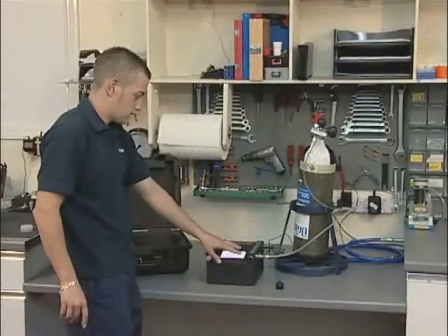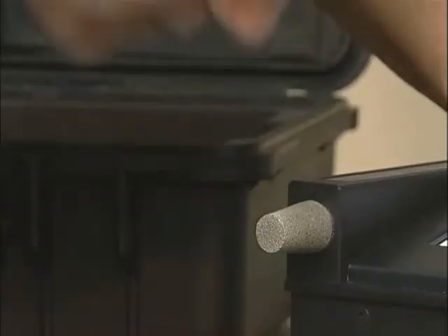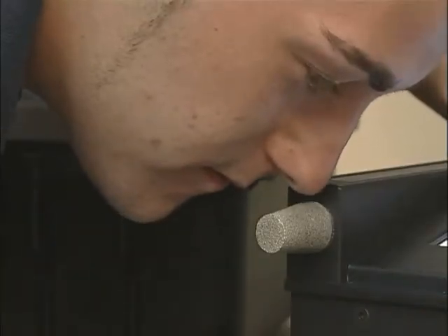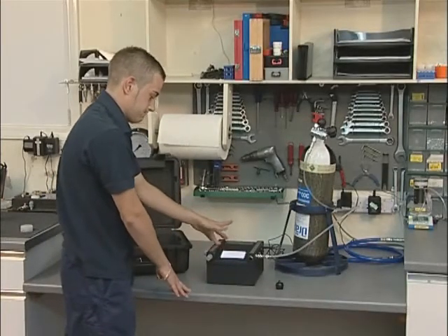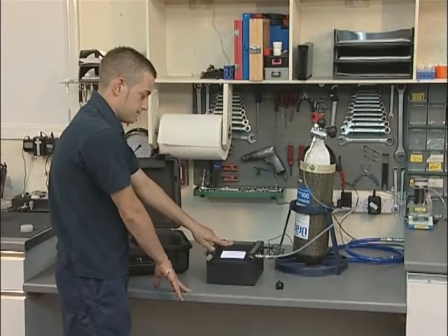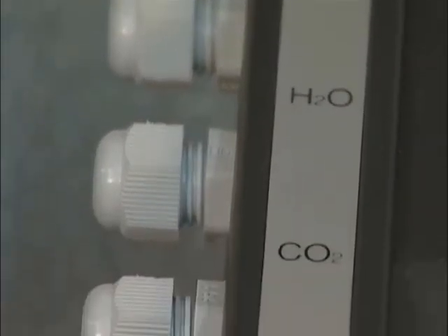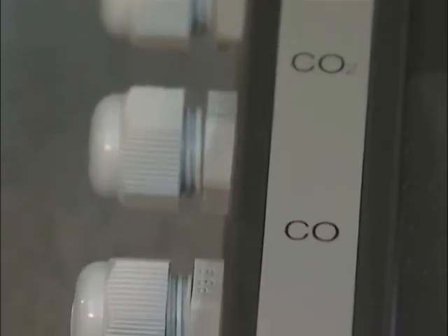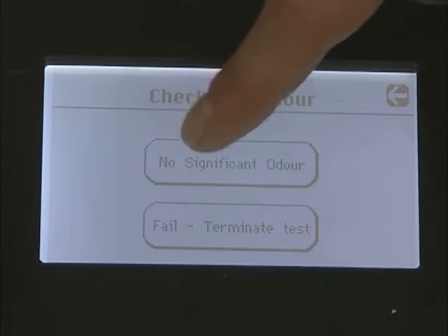Carry out the odour test by briefly pressing the odour test button and smelling the air exhausted from the sintered outlet. If there is a serious odour problem, fail the sample at this point of the test. Initiating flows of seriously contaminated air through the tube ports could result in damage to the unit. If the odour test is satisfactory, press the key to continue.